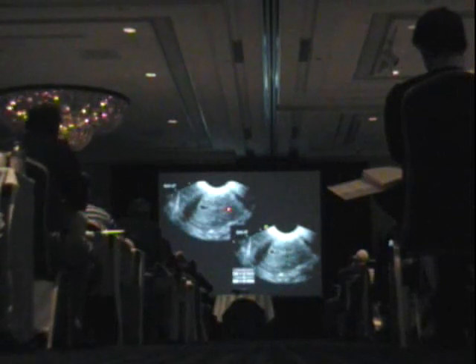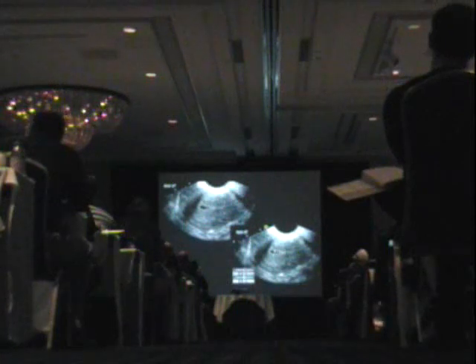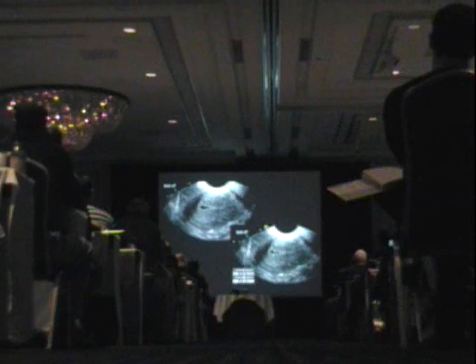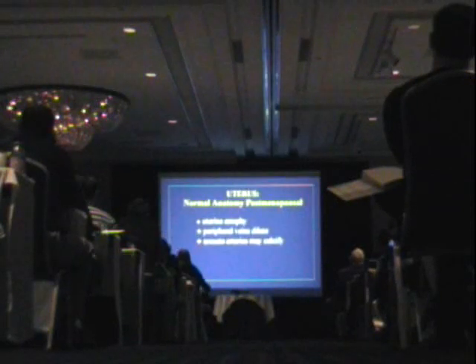Here's an example of a patient who presented with a little bit of fluid in the endometrial cavity. And frequently when patients present with menses still ongoing, we do see a little bit of fluid in there. You can see that we've chosen to measure the front stripe and the back stripe, 1.2 millimeters and 1.4. So this endometrium would be linear at 2.6 millimeters. You add the two measurements together, and do not include the fluid.